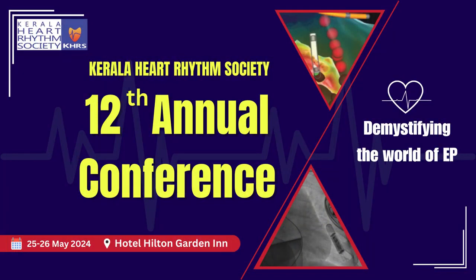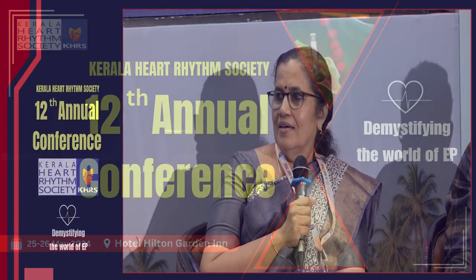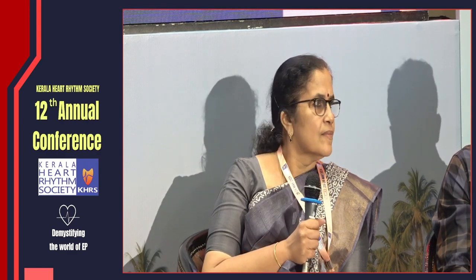Vilash, let me ask a non-EP question. Have you seen any left anterior descending artery injury? I have seen a case report by Shanmugam. He published a septal injury in one of the cases. We haven't come across it. Maybe we don't place the lead that anterior, because most of the time the natural curve of the sheath takes us to the posterior portion, which is away from the LAD septals. If you try more anterior, like an anterior fascicle capture, we may get into the septum. What is your opinion, Shan?